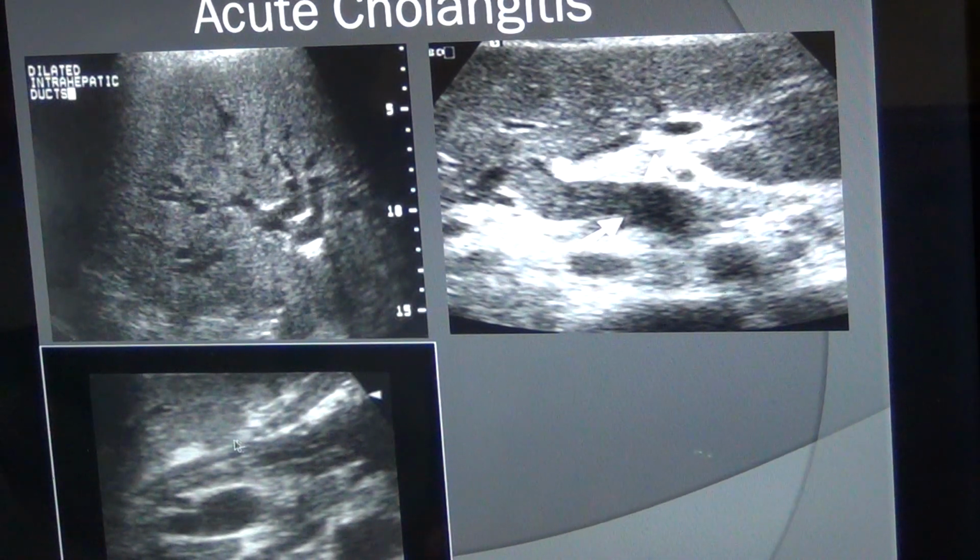Okay, common bile duct. In this way, you can evaluate the situation of the bile ducts by multiple images. So make sure you learn how to get the porta hepatis to see the bile duct, extrahepatic bile duct and intrahepatic bile duct. Make sure a physical examination is done along with the sonographic examination and blood report.